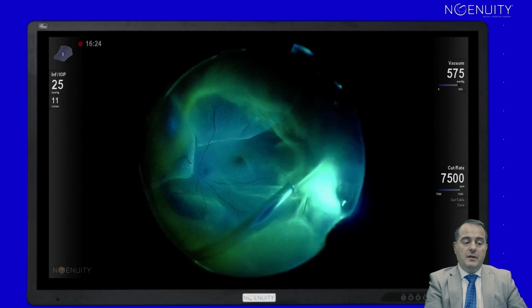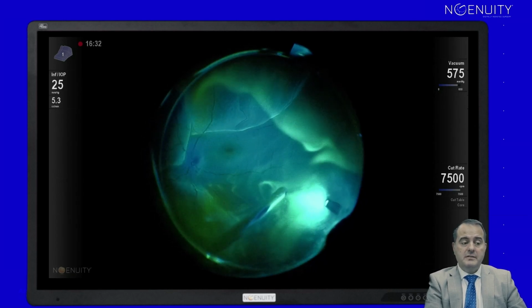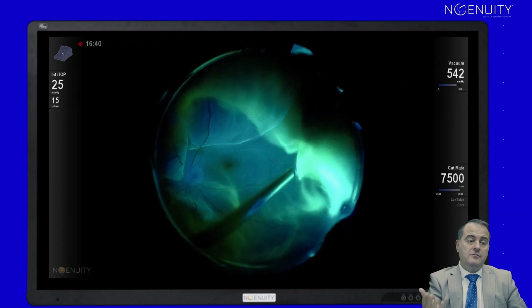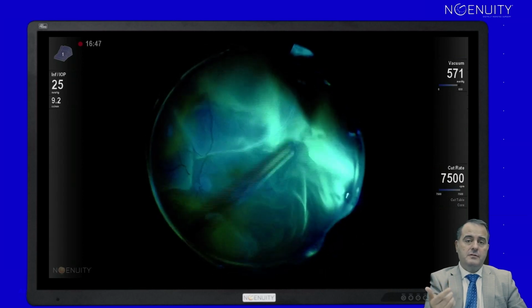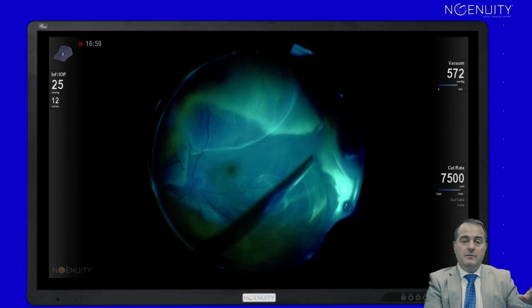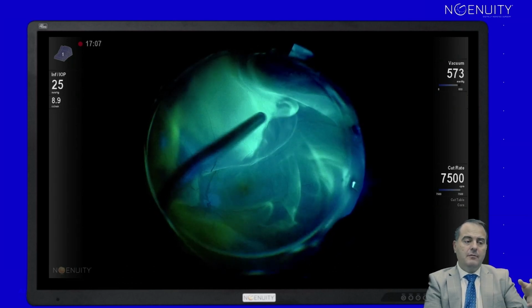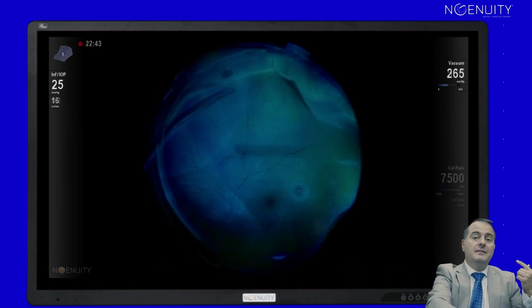It's called fluoroscopic vitrectomy, where we are using solution of fluorescein to dye or to stain the vitreous. It's absolutely indispensable in the vitreous periphery because it stains the stroma of the vitreous, not like the rest of the vitreal staining agents, which are staining only the surface of the vitreous. So here, with extreme low concentration of fluorescein solution, we are achieving fluoroscopic visualization because we have fluorescence from the fluorescein, and that way we can clean perfectly well the vitreous, and we can also visualize all the relationships between the vitreotome cutter and the vitreous, whiplash effects, jumping of the retina, etc. Things which we don't need to anticipate like up to now. We see in real time.